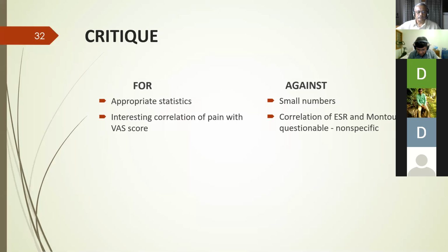Yeah, correct. I thought the same, and I think they should have been offered diagnostic laparoscopy. Yes. When the pain persisted and PET CT was negative, to really know what the cause is before sending him to a psychiatrist, I think the study should have naturally progressed to a diagnostic laparoscopy, particularly because the patient is not going to pay for it in AIIMS. So that's something they could have considered.